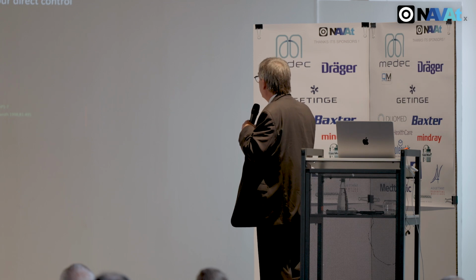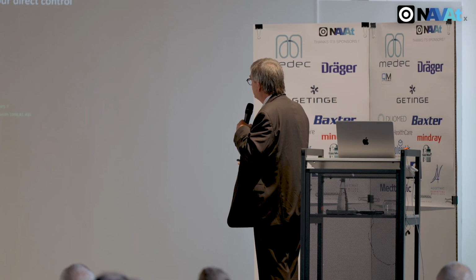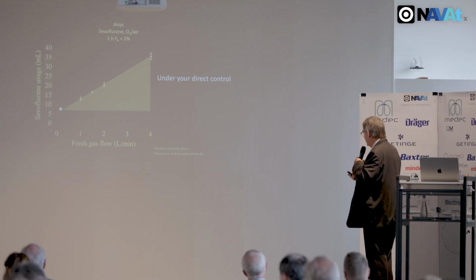This amount is directly under your control. When this is the amount taken up by the patient and needed to prime the circuit, this is the amount that's directly under your control by manipulating the vaporizer.